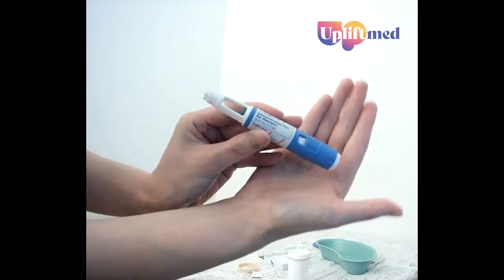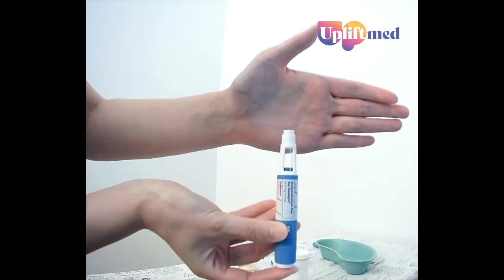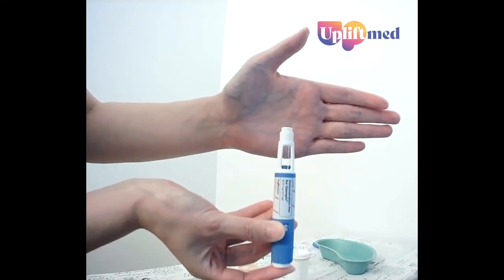We're going to hold the pen upright and release, and a lot of fluid will go everywhere now.